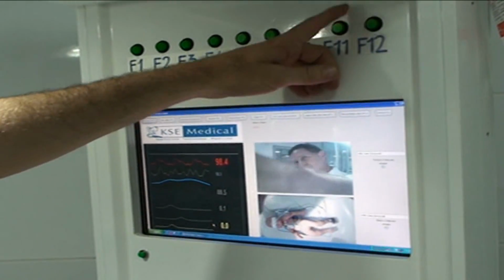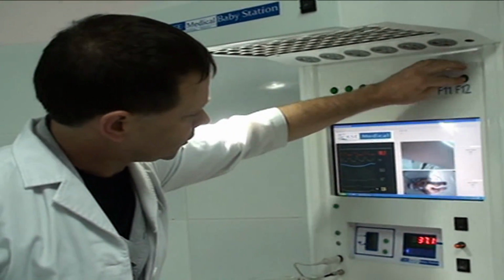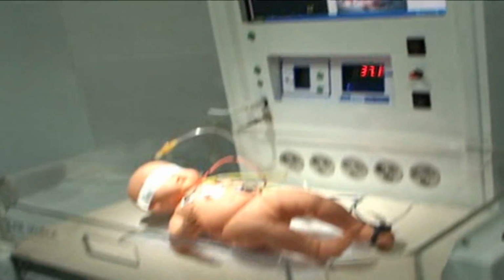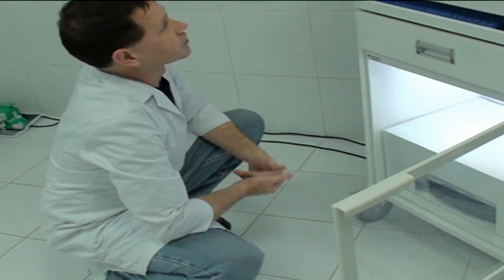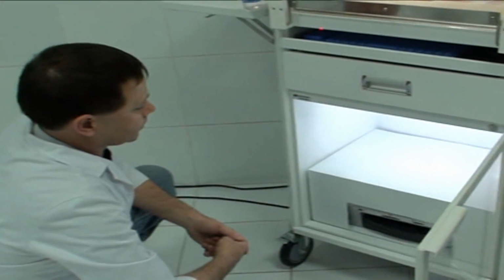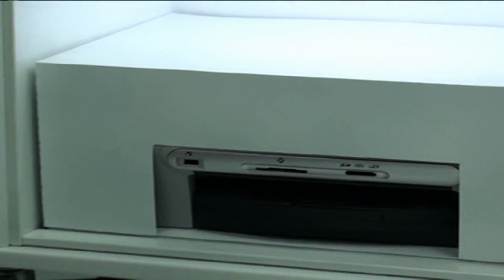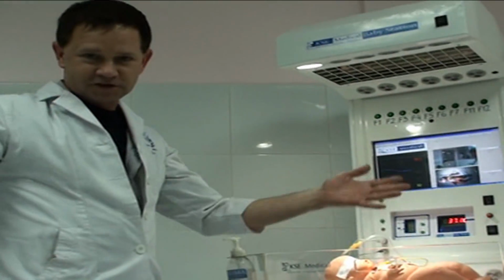Then finally, what we have is, there's never finally with the BabyStation, but for now, F12 is, for example, anything that's on the screen here, push this button, and you can print to paper or save to USB, whichever you choose. And down here we have storage cabinet. We have our shelf with storage space and things like this, another storage space. And then we have our printer so you can print out any data you need. It's a full A4 color printer, and you can get all the patient vitals, a picture of the baby, whatever your record screen is showing it prints. Very simple to use, one button action. So that pretty much covers the BabyStation for now, and we'll give you more information after the machine later.